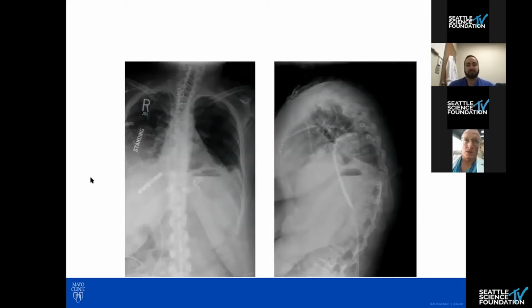My thoracic surgery colleagues reconstructed a rib. This is the immediate post-op standing images. So unfortunately, we haven't had any recent weight-bearing imaging. But you can see we replaced her with carbon fiber instrumentation. Her recurrence qualifies her for post-operative radiotherapy now.